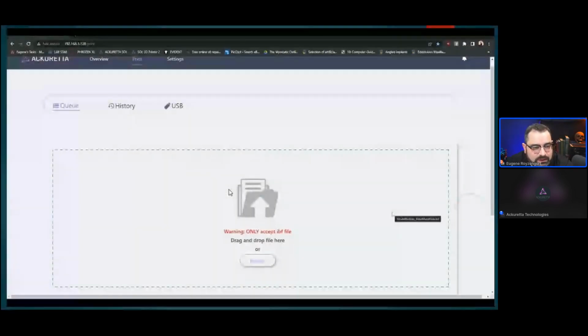It takes a little bit of time sometimes, because it's all online, right? It depends on how busy the server is, how large the file is, and what your internet is like. Sometimes I'll wait like a minute for the file to upload, so take your time. One of my printers uploads faster than the other. I think it's because I haven't updated the firmware on one of them, and it's taking a little bit longer.